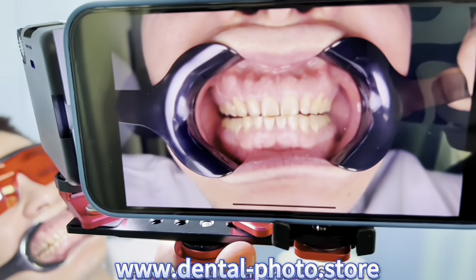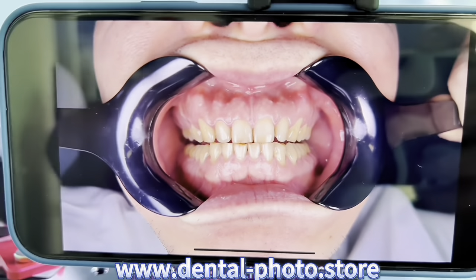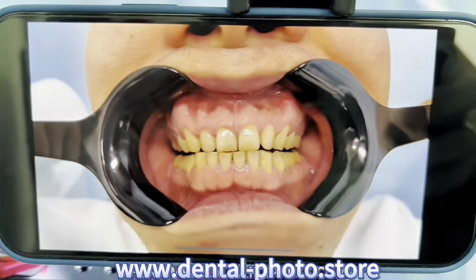Let's take a look at the photos. Here is the first one — the one with the light. As you can see we get the true colors and the lighting is efficient to illuminate all of the oral cavity. And this is the photo with the light off.